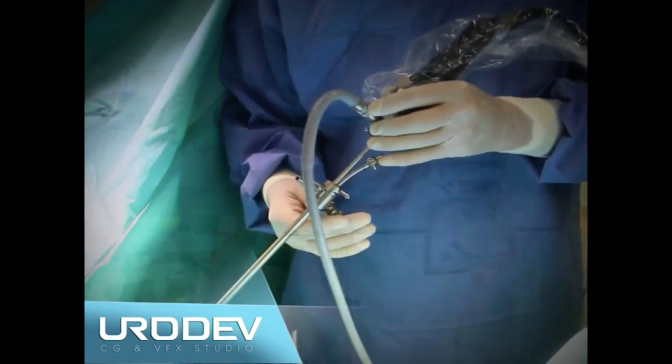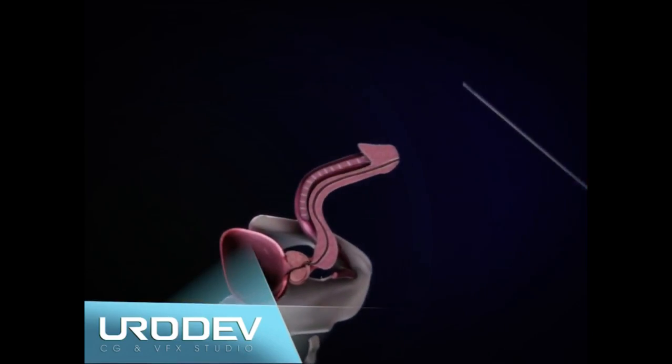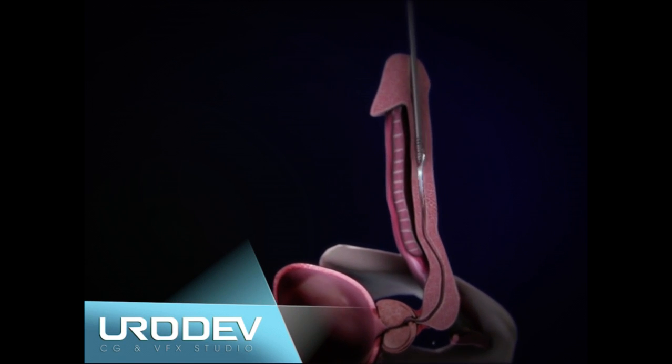This technique is used for high-volume prostate size, over 60 grams, and is based on enucleation of hyperplastic prostatic tissue by means of Holmium laser cut.